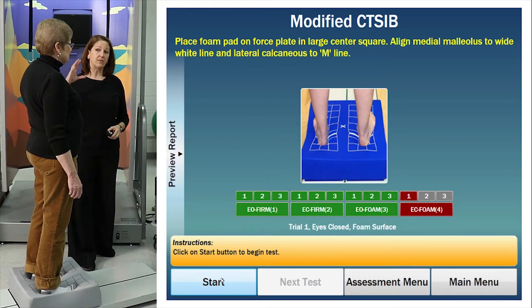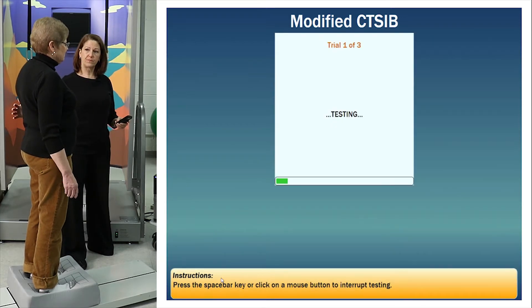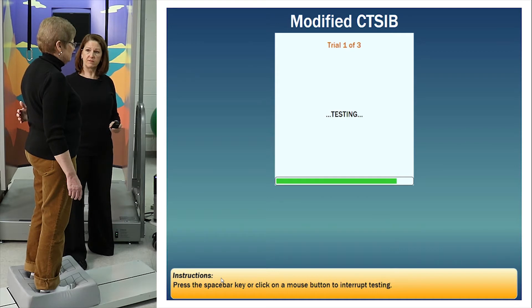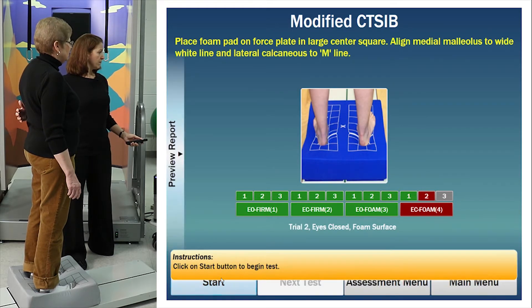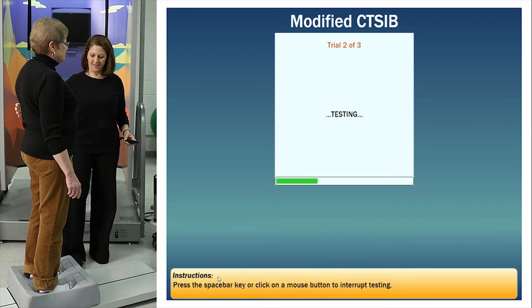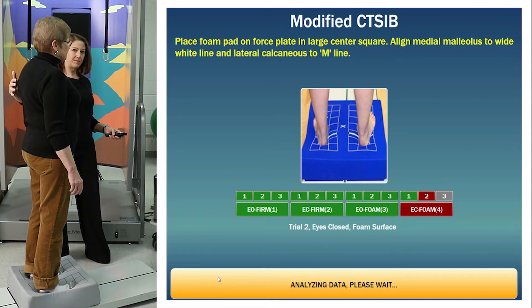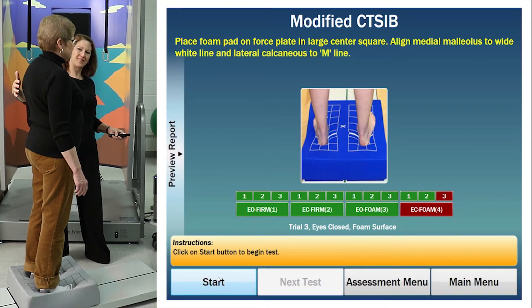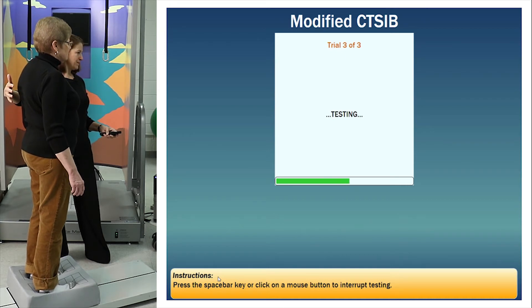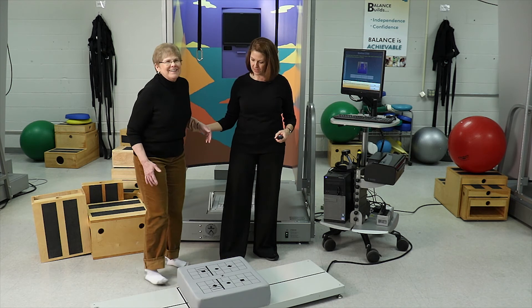Now we're going to do the same thing but with the eyes closed. I'll tell you when to close them and when it's okay to open them again. Get ready — close your eyes, testing. Open. Same thing again — close your eyes, testing. Open. And one more time — eyes closed, testing. Nice job. Step down to the front or the back. Nice job, Liz.